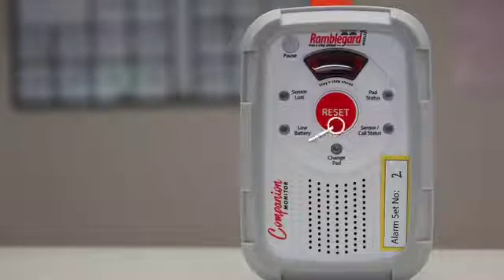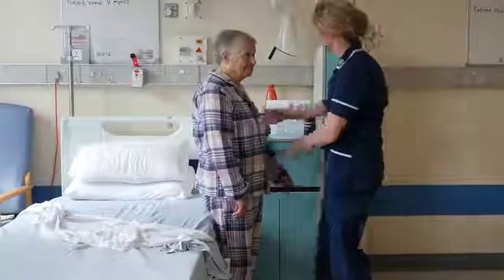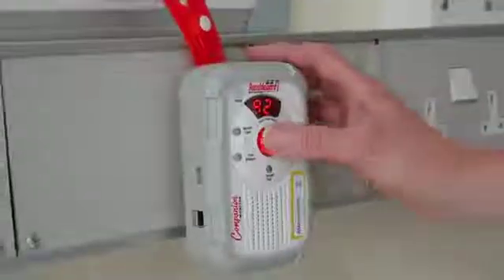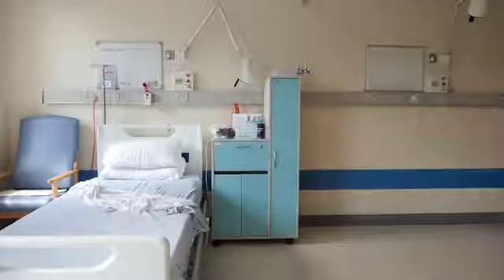The reset button is pressed to clear any active alarm. When used as part of the wireless ward system, it has the ability to send pause and reset signals remotely to the central display panel from the patient's bedside.